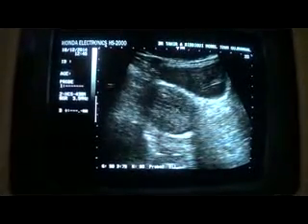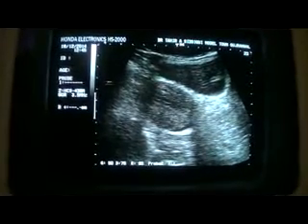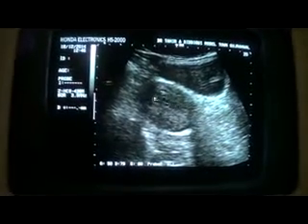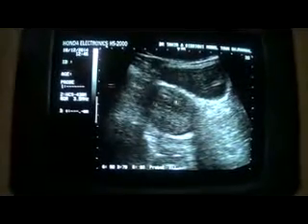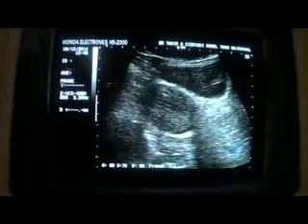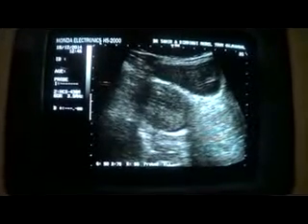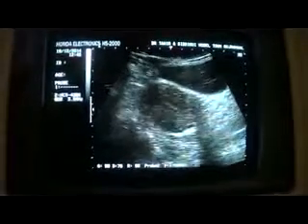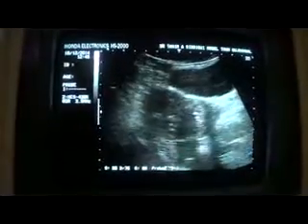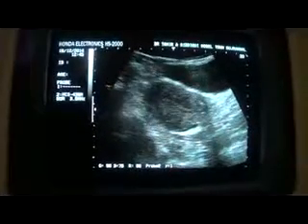See, it's in early proliferative phase. Anterior myometrium is okay, posterior myometrium is doing okay. No focal lesion seen here, it's central, no clots, RPOCs, nothing is seen, it's clear. Endometrial canal is clear. This is the urinary bladder, this is the longitudinal view. And as I move the probe, now this is the full length of the uterus, showing you the endometrial canal.